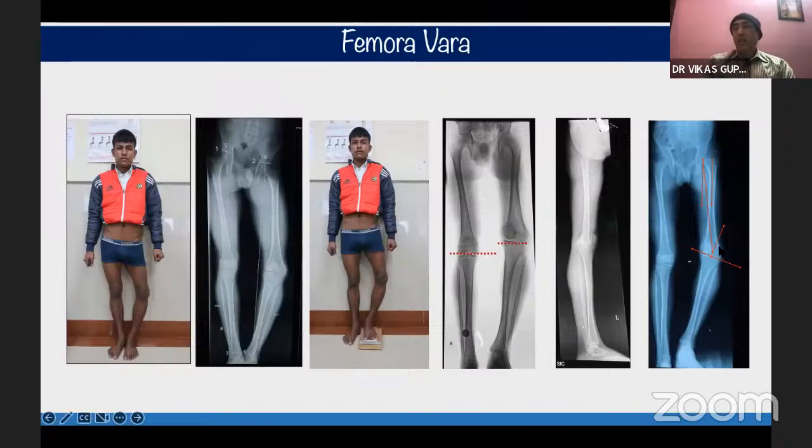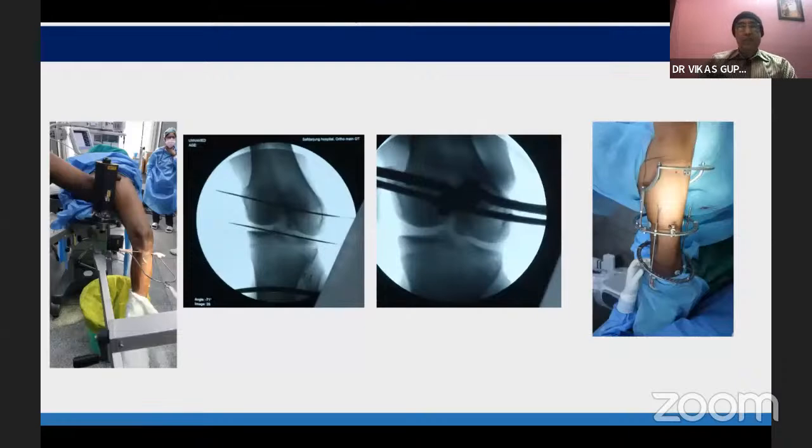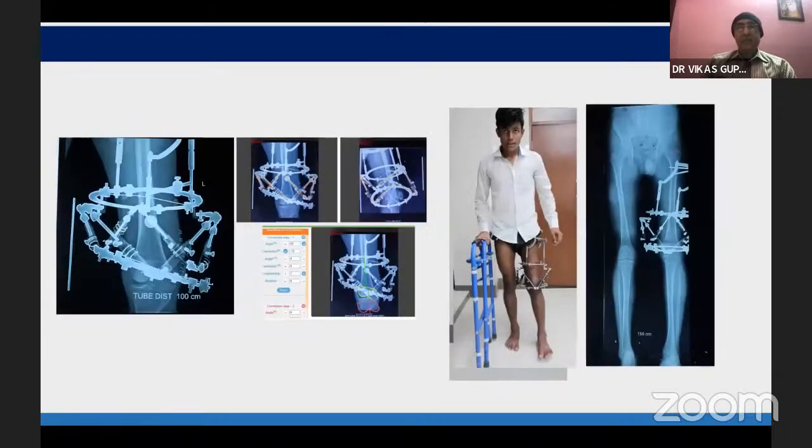But we cannot make a corticotomy here, so we expected a translation. So that is rule two, basically. Similar to the other cases of the femur, we flex the knee joint. And this is the position. And that's his correction, just immediately post-op.